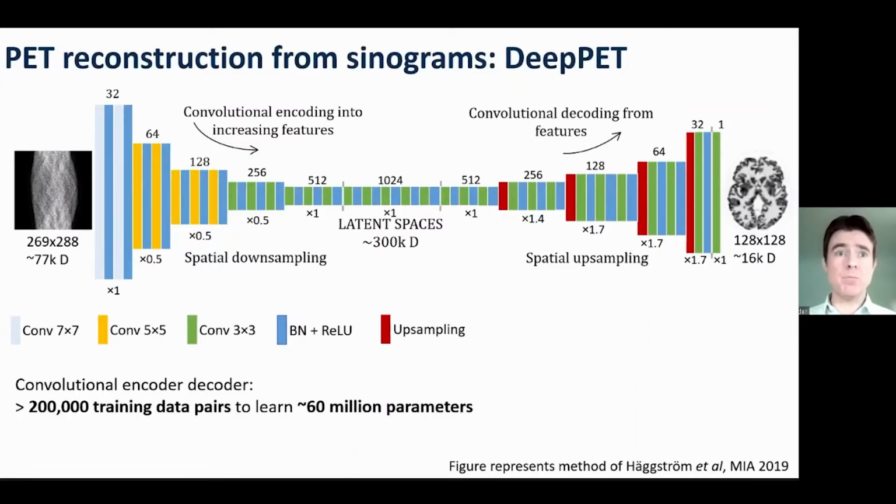So what they did was train up this convolutional encoder-decoder, and just to point out two things: they had to use a huge quantity of training data to code up this entire mapping, which needs to learn everything, the Poisson stats, the imaging matrix, the system matrix, is all learned here, which is a pro and a con.